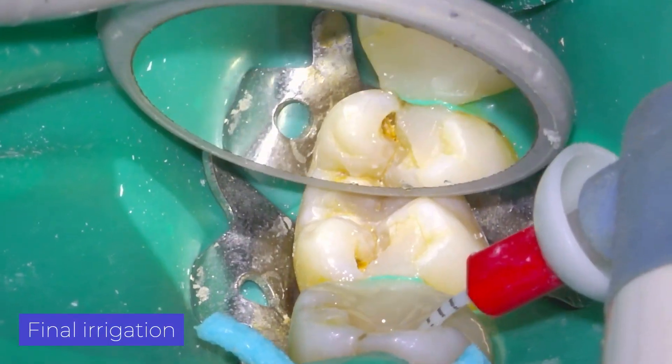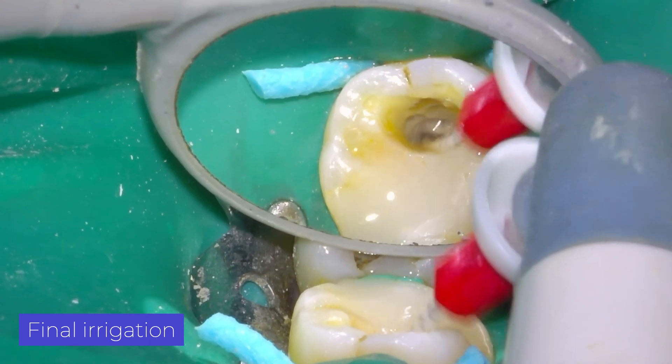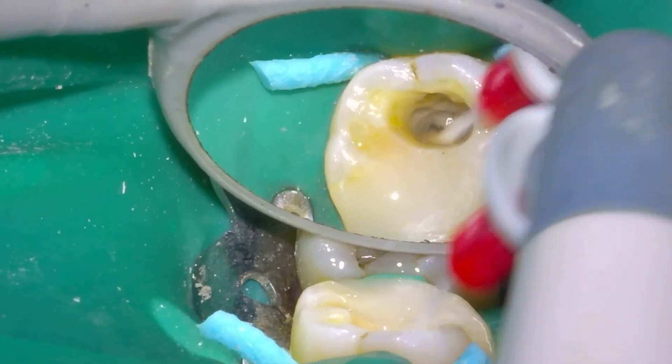In the last irrigation, we activate hypochlorite sonically, then EDTA 17%, and finish with sodium hypochlorite.